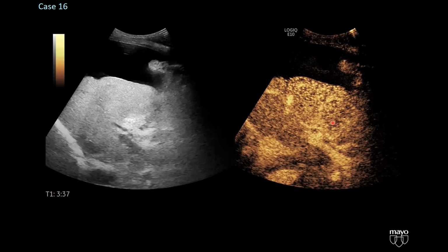So we did a contrast study. You can see here this portal vein, which is hypoechoic compared to the liver, on this image that's got the low mechanical index, basically filled with flow with the contrast. By the way, that's at the same time. These are dual images, so it's not later. This is at the same time.